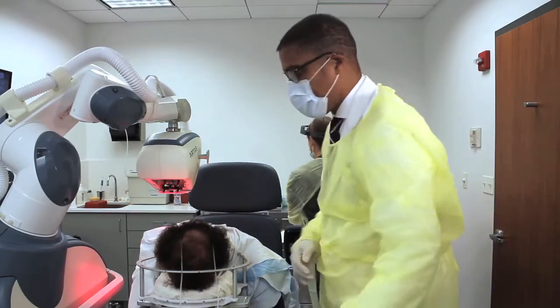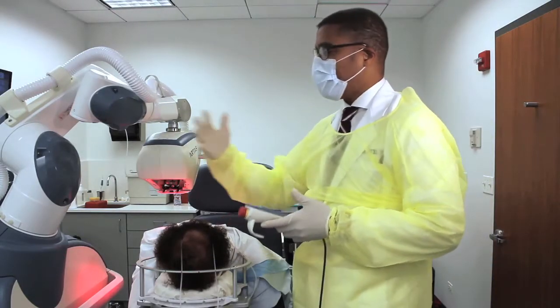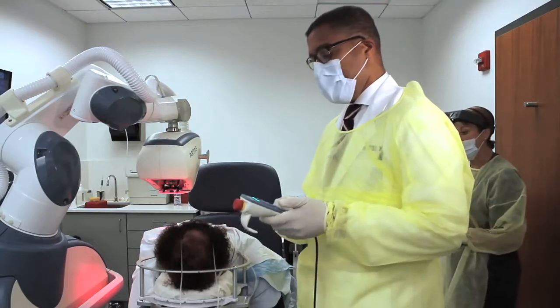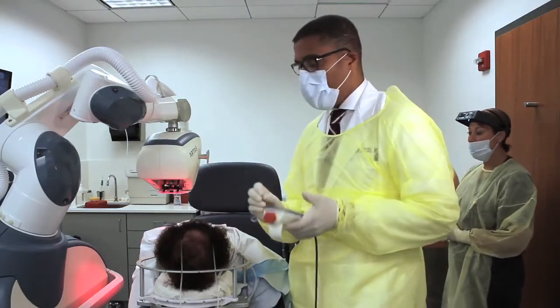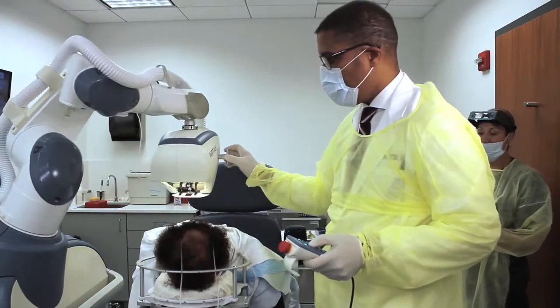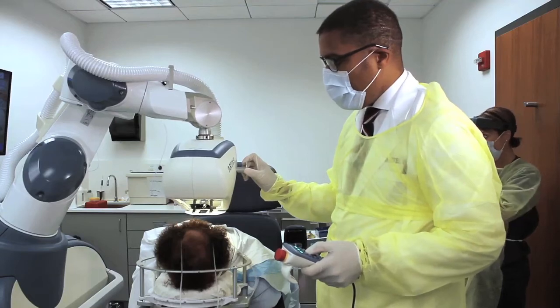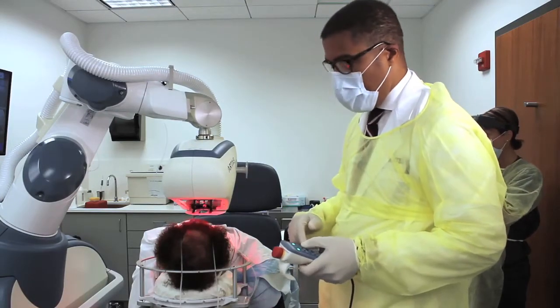This is called the pendant, and this controls the ARTAS, so it's just not the computer doing its thing. The doctor has to control the whole procedure. So here we go. All you have to do, Pat, is stay just like you are.